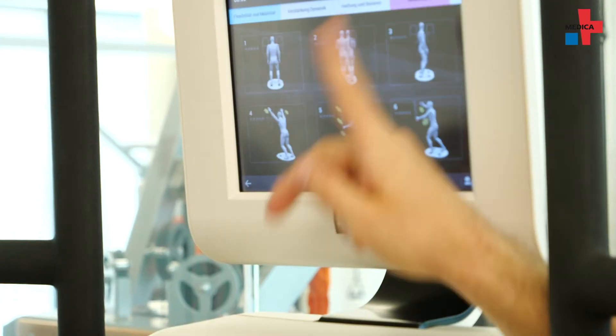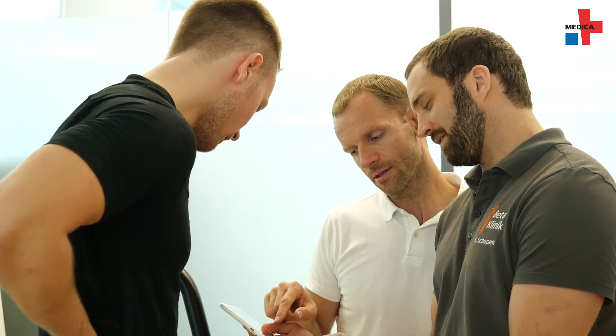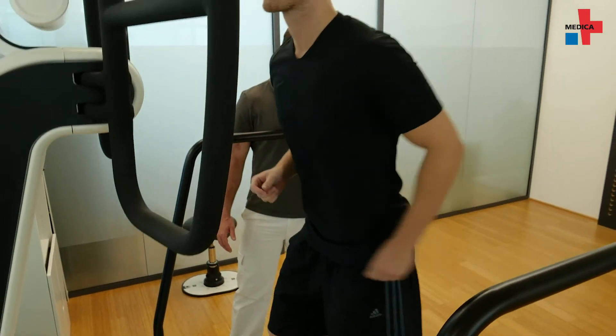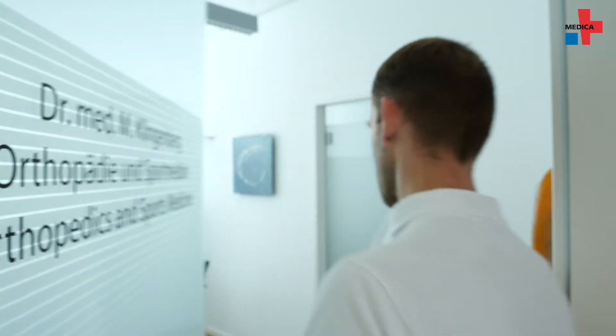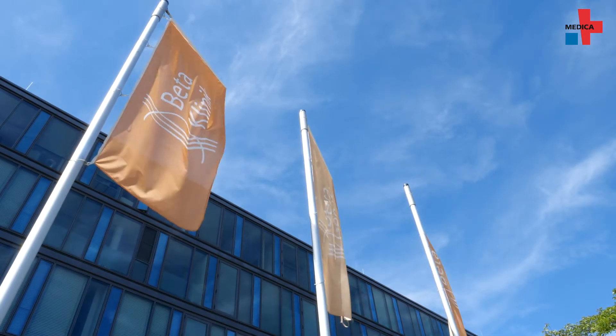The doctor can easily control the training and choose the best training option out of numerous training forms for the patient. An individual program can also be created. The training is well accepted by our patients — adjusting the physical limits individually means neither under-strain nor over-strain occurs. The Huber 360 offers playful forms of training which promote a certain stimulus and compliance, such as performance tracking. This is one of its main advantages.